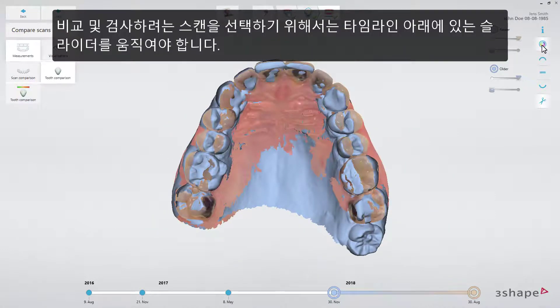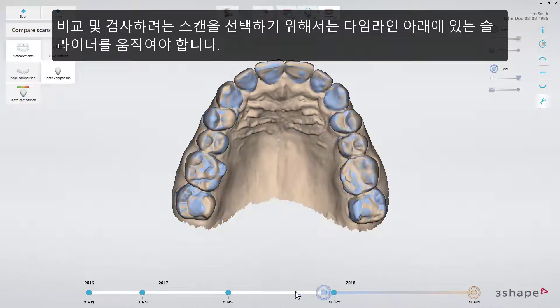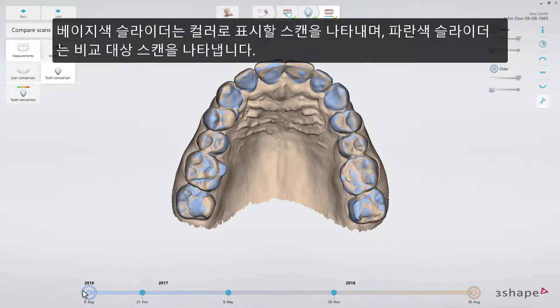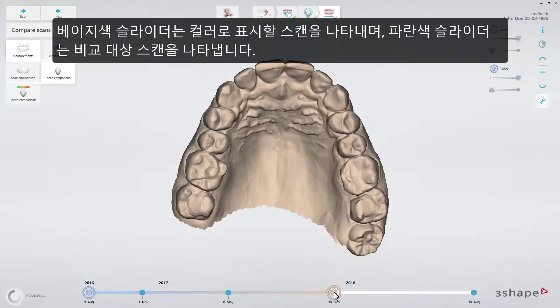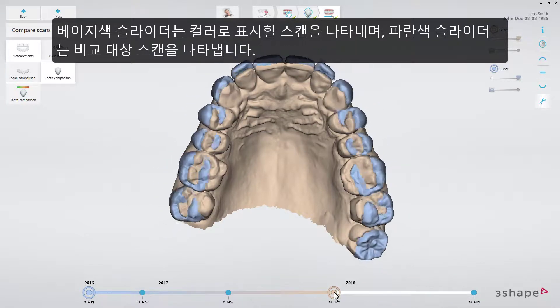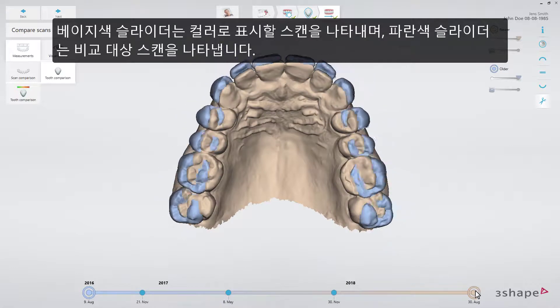To select which scans to compare and inspect, move the sliders underneath the timeline. The beige slider controls which scan to display in color, while the blue slider controls which scan is being compared to it.